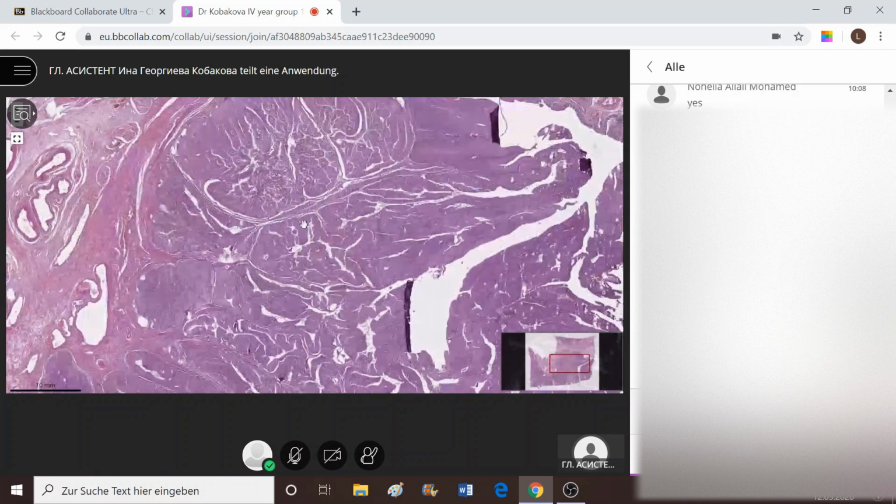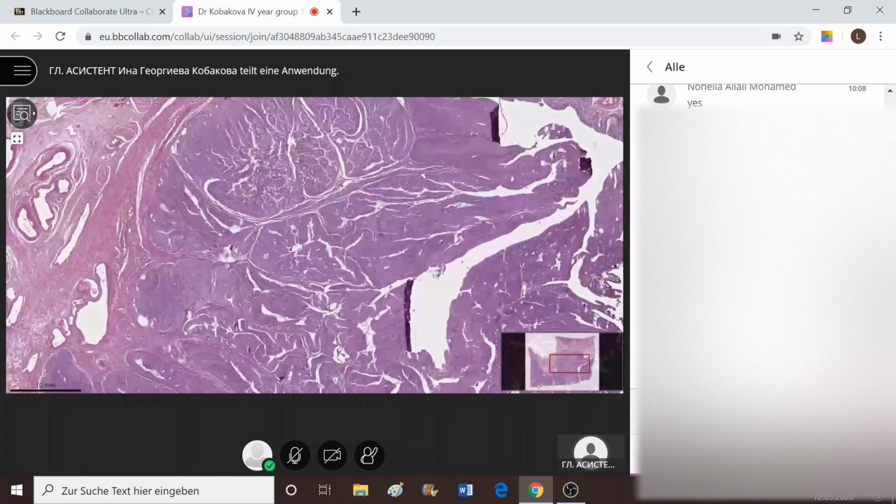the cells. Of course, here again, we should mention all of the features of cellular atypia, which might be larger number of mitotic figures, disturbed nuclear cytoplasmic ratio, polymorphic cells, different cells, cells with a couple of nuclei inside. Also, presence of nucleoli centrally in some cells might be observed, eosinophilic nucleoli. Also, such stuff that we usually mention about malignant tumors.